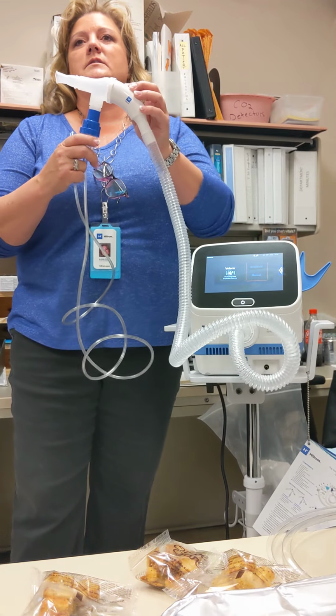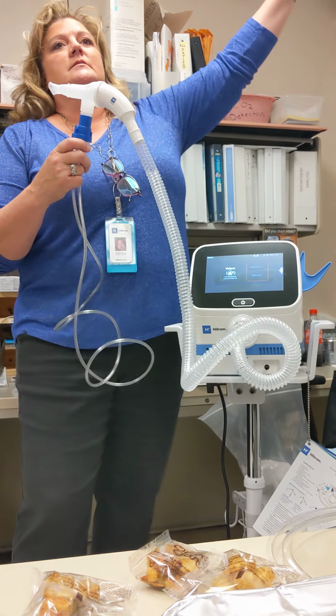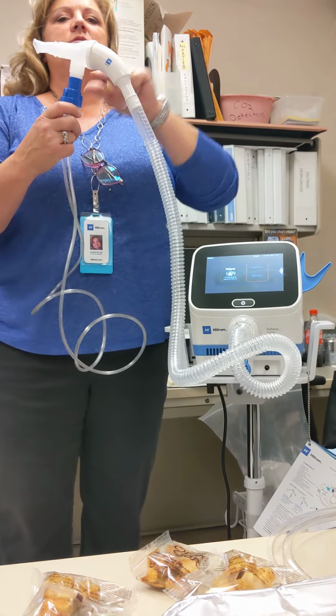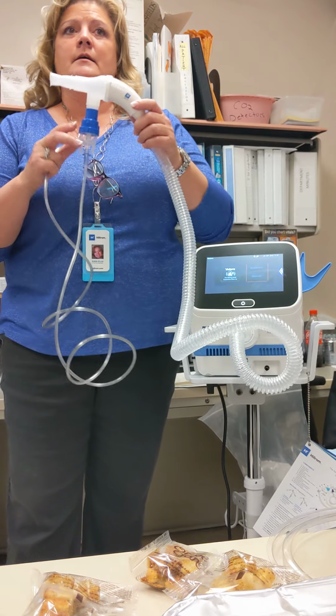One is the way the cone is designed. If you look, there are two gills on here so it exhales your CO2. But you don't see the mist. If you saw that on the MetaNeb, you had mist. You don't see that on this. Because of the cone, it comes back and it rains back into your nebulizer. So that's why you see excess.